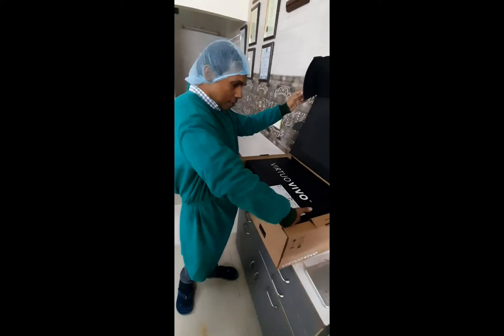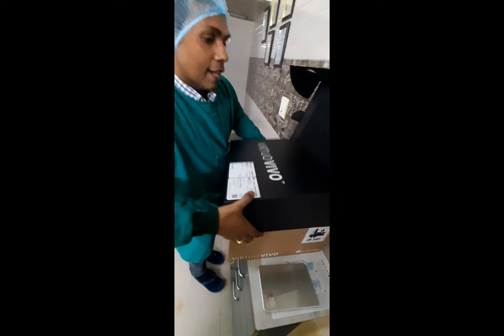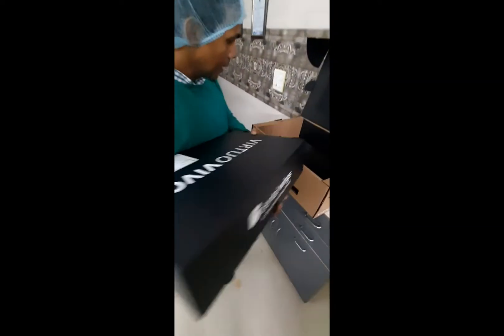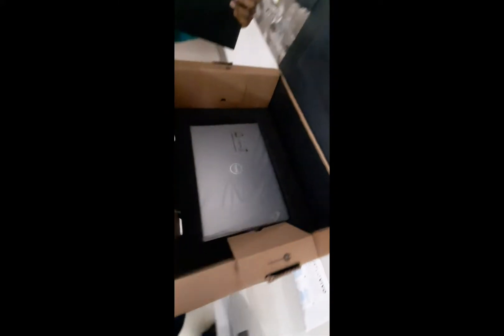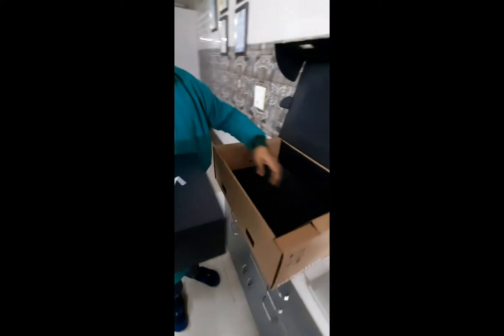Let's see what's stored inside. So we have the Virtue Vivo. It looks pretty exciting. This is the scanner and you also have the brand new laptop that is by Dell. We will just open it in a while.